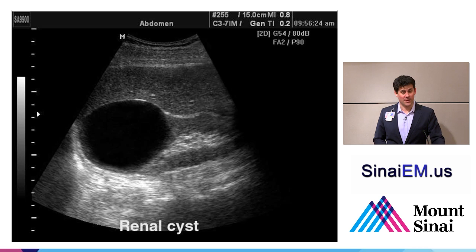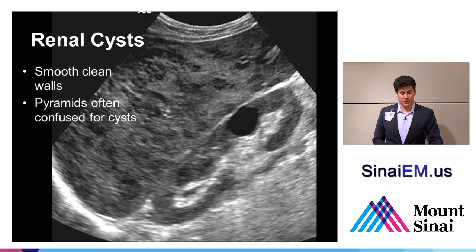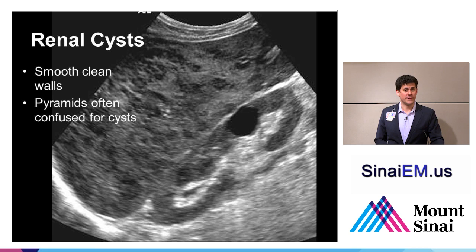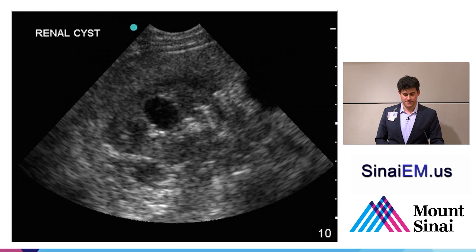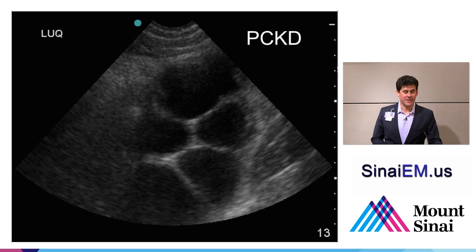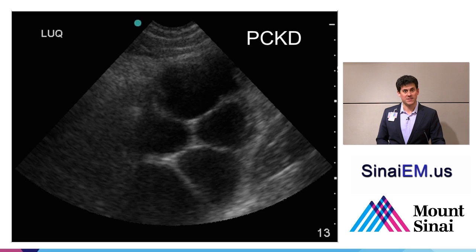Here's another example of a very large cyst — the rest of the kidney looks normal, there just happens to be a large cyst at the superior pole. Cysts typically have smooth, clean walls. You can confuse renal pyramids for cysts, but cysts are relatively circular or spherical across all three dimensions, while pyramids taper towards the center of the kidney. With polycystic kidney disease, there are so many cysts they do displace the renal parenchyma — an important finding with implications for renal function that warrants careful documentation and appropriate follow-up.